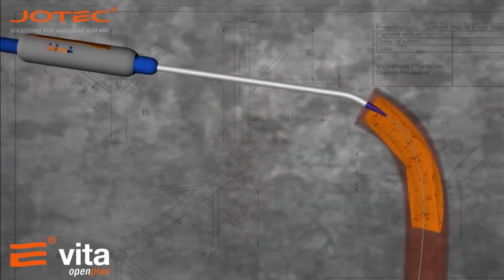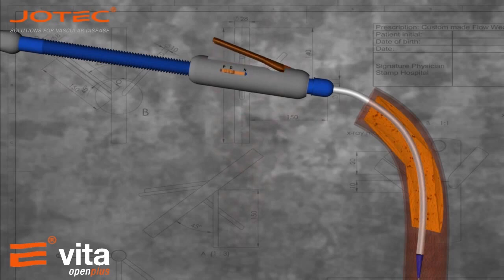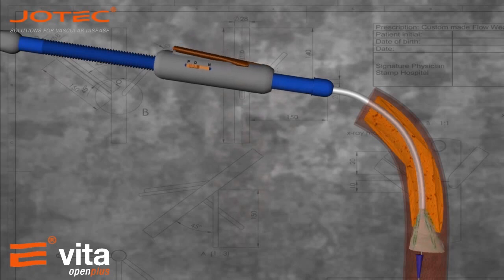Introduction of the Evita OpenPlus stent graft. Deployment of the stent graft and anchoring to the aorta with polypropylene 2-0 or 3-0 sutures.